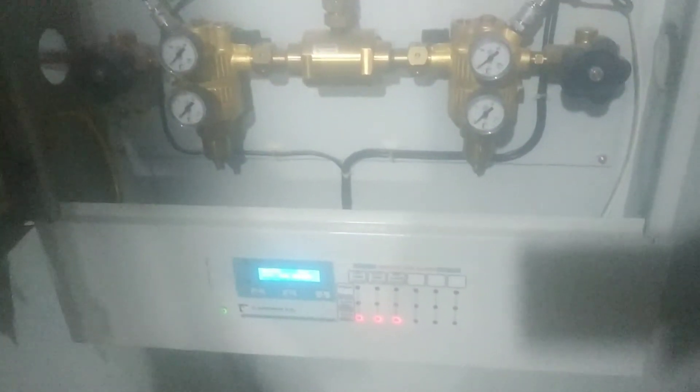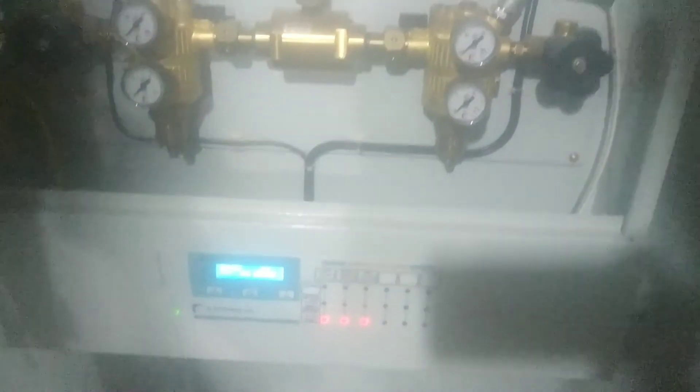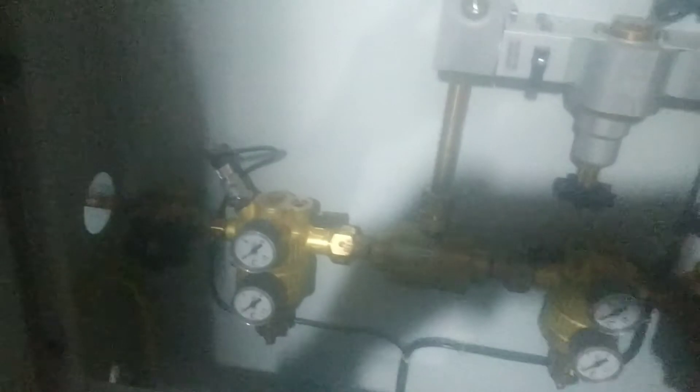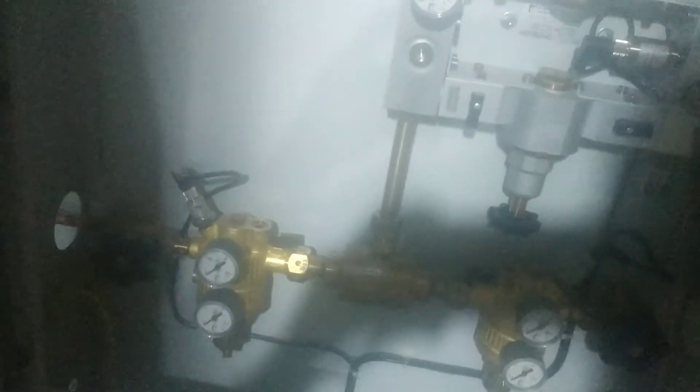Right now there is no oxygen connected, that's why we are seeing those alarms indicating no pressure. These are the valves to open or lock the oxygen supply, and these are the gauges to read how many bar of oxygen is being delivered to the system.